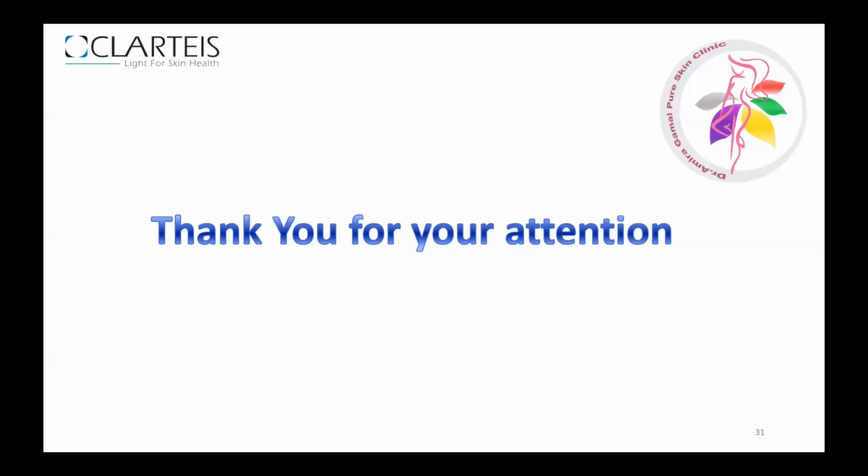Okay, and it is clear. So, to answer these questions in a simple way, for acral vitiligo you are combining Exciplex with CO2 laser, topical treatment, and microneedling. And how many sessions does it need to start to see the first results? To see the result in acral vitiligo, it takes about 10 sessions. You will start to see the dots of the melanocytes start to repigment again. Then you will see the improvement according to the case, according to how old it is. Okay.